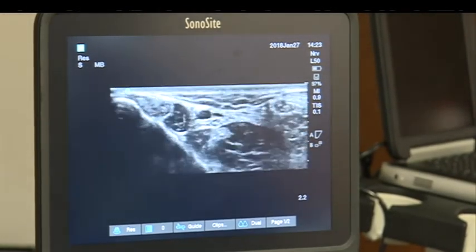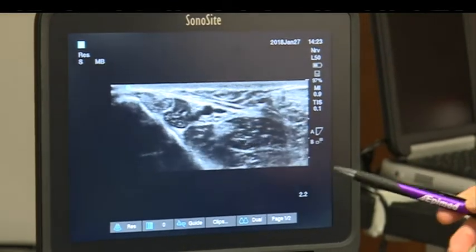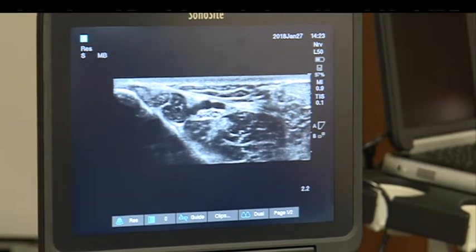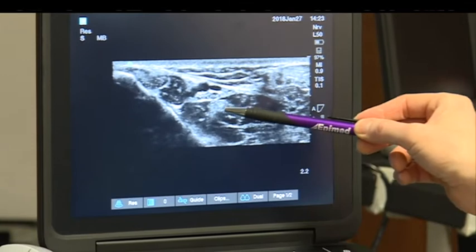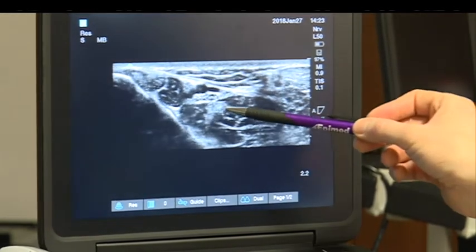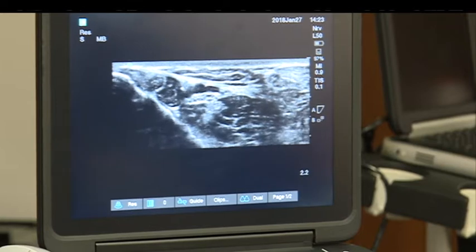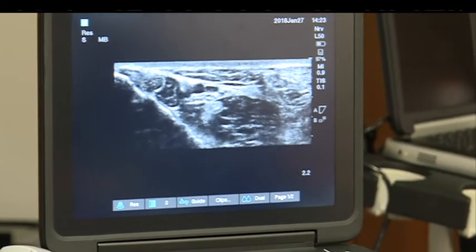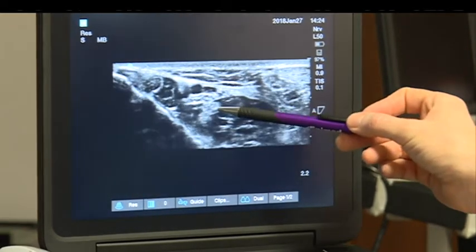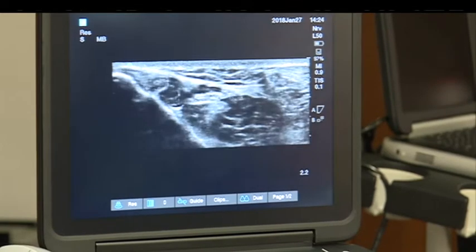Scanning down, this is flexor hallucis longus — the muscle underneath — and you can see the formation of its tendon beginning. This is the 'Harry' part of Tom, Dick, and Harry. The tibial nerve sits nicely above the fascial layer, but importantly the tendon looks very similar to a nerve at that level. In about one in 30 or 40 cases the nerve is on the other side of the artery. The tendon is a close distractor for the nerve, so just be aware of it.